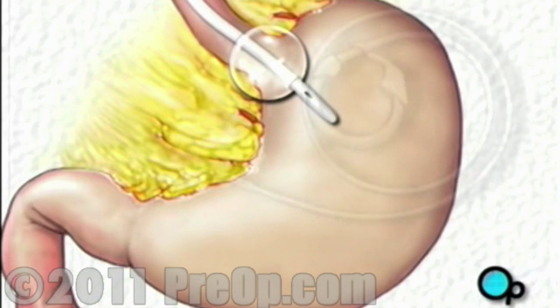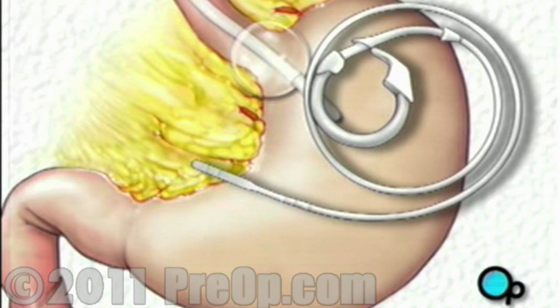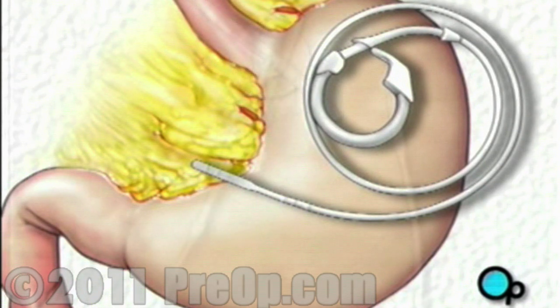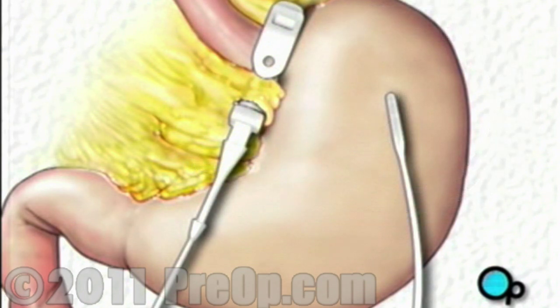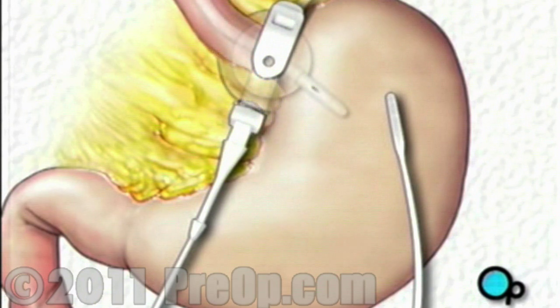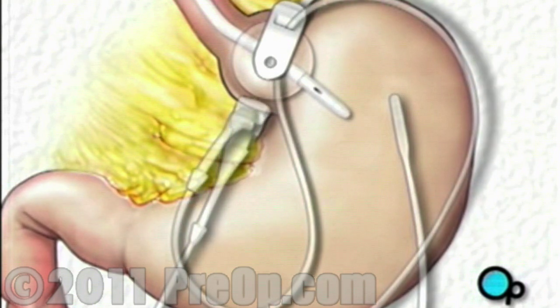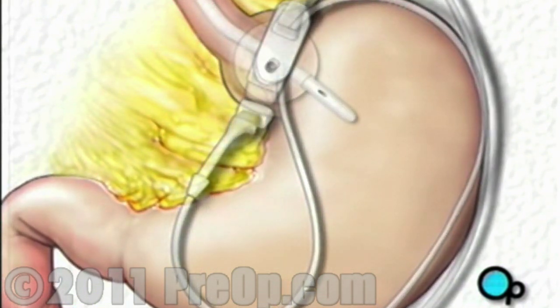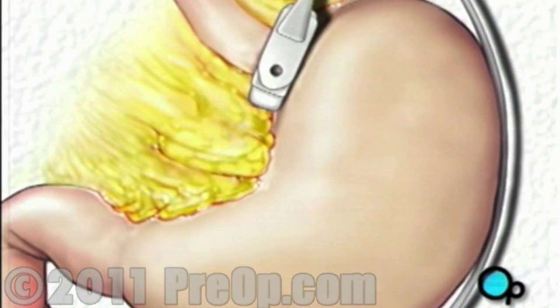Next, the team will insert an adjustable band into the abdomen. After deflating the balloon, your doctor will guide the band until it circles the top of the stomach. Once the band is in place, the team will check the position by reinflating the balloon. After making any final adjustments to the position of the band, your doctor will tighten and lock it into place. Next, the team will fill the band with saline solution, causing it to further tighten around the stomach.